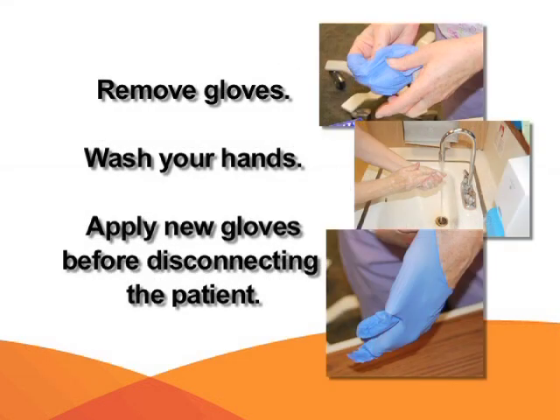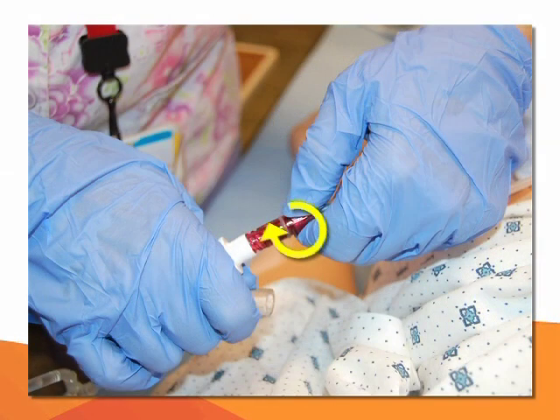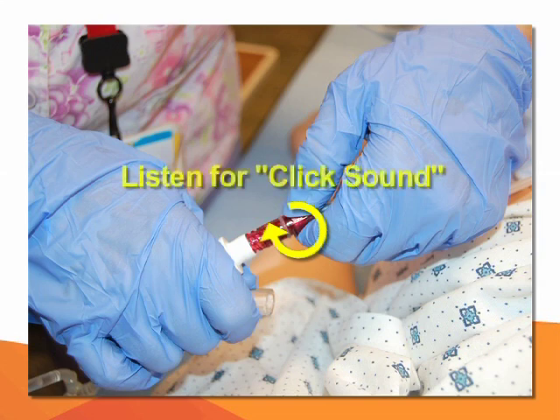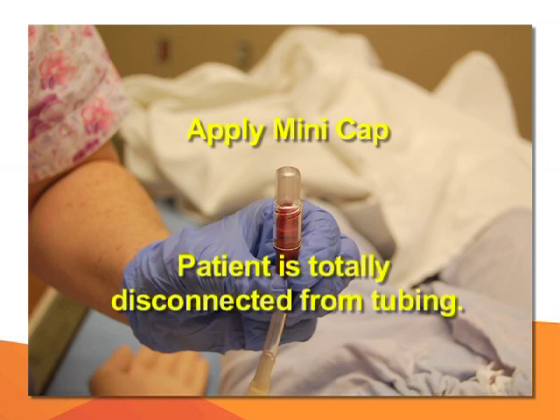When the infusion is complete, remove gloves, wash hands, and apply new gloves before disconnecting the patient. Close the blue clamp and close the patient's catheter clamp — the white connection or another color. Remember to listen for the click on the patient's exit side line and apply the mini cap using aseptic technique. The patient should now be totally disconnected from the tubing.